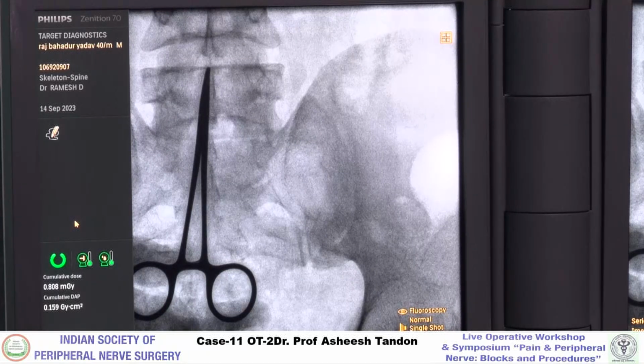Okay, sir. So in this, we are first trying to get that flat parallax. Yeah, we have removed the, so the end plates are absolutely parallel.